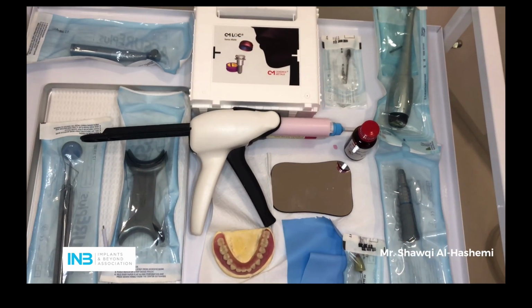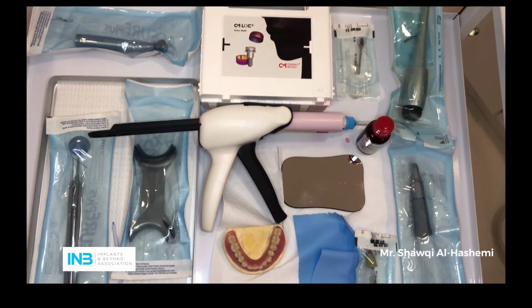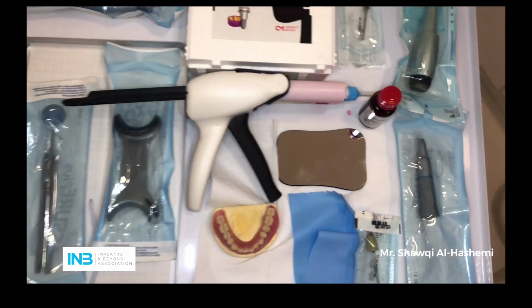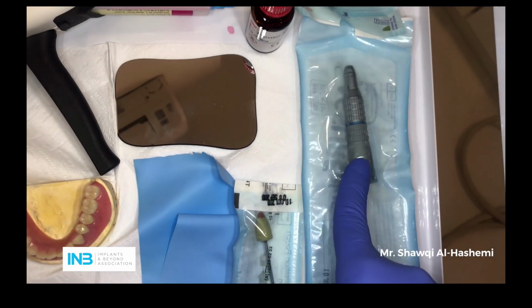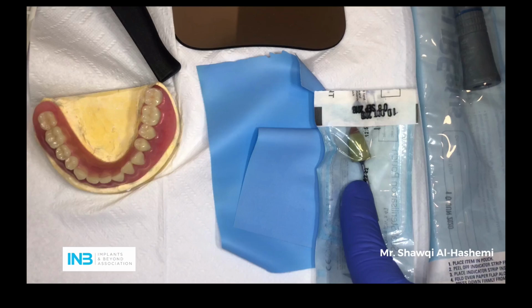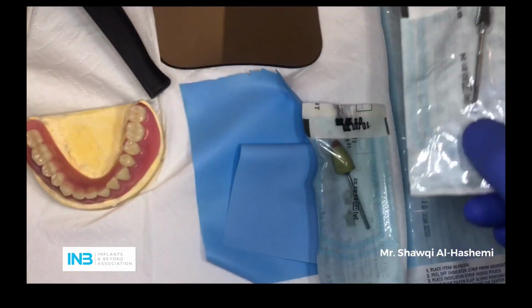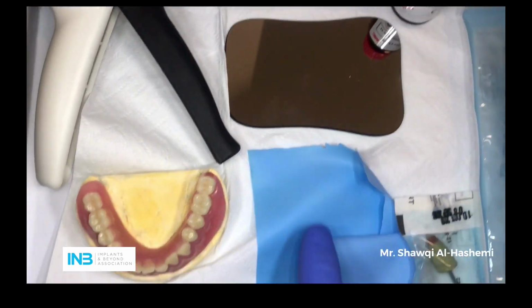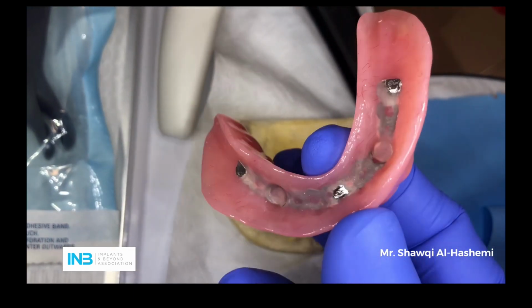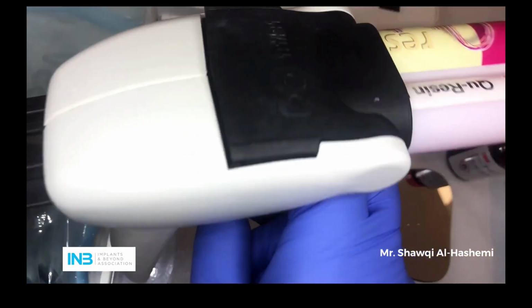Right, in order for us to finalize an implant-retained denture, you require all these instruments as well as the materials. You need an acrylic handpiece, a polishing bar, as well as an acrylic bar, a mirror for you to take some photos, a rubber dam, and the actual prosthetic work, as you can see here, that is needed. You need your gun for the resin.